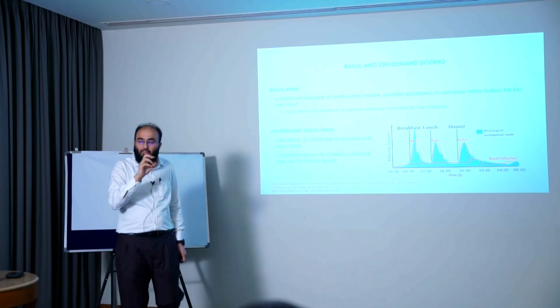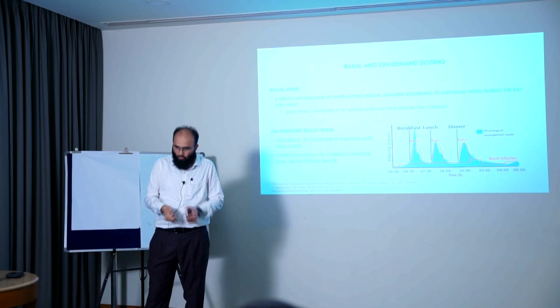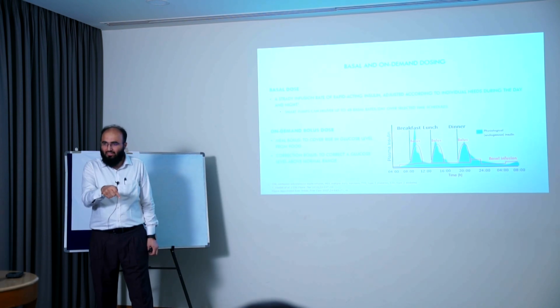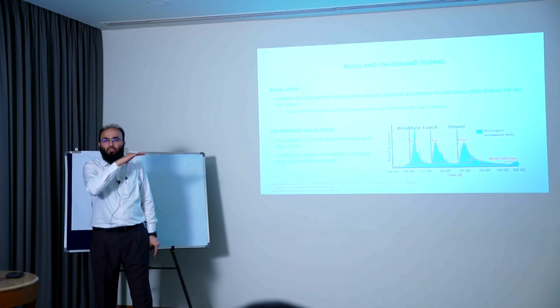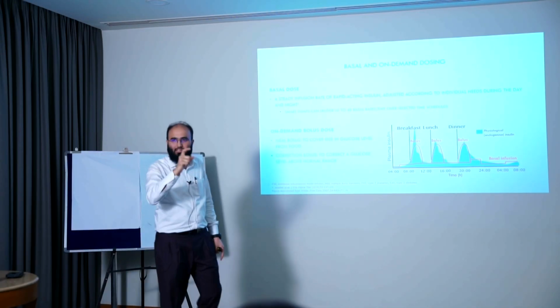And bolus also, the pump, what is the lowest bolus that the pump can give? So you have entered carbs. What is the lowest bolus that the pump can give? It's 0.0. Even if the user enters, I am having this carbohydrate, and if it knows that he is vulnerable to hypoglycemia, it is not going to deliver any insulin. 0.0 units insulin delivered. Okay, you will get the message.